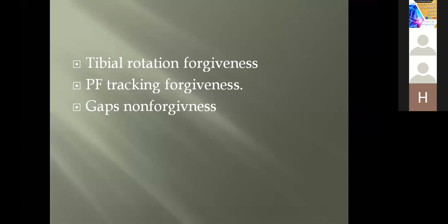The tibial rotation forgiveness. Many patients, especially in the Middle East and in Egypt, when you adjust the rotational position of the tibial implant, put you in a dilemma whether to adjust with the tibial tuberosity, with the anterior chin of the tibia, or with the center of the ankle. You have spent 10 or 15 minutes in some cases trying to solve this problem. If you are using a mobile bearing design, which already allows 15 degrees rotation each side, you have to worry less about this problem because it's forgiving for 10 or 15 degrees of rotation.